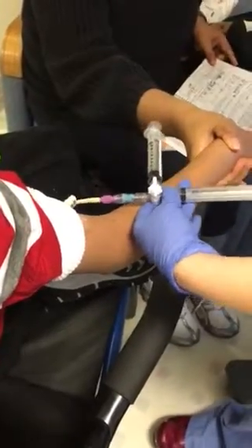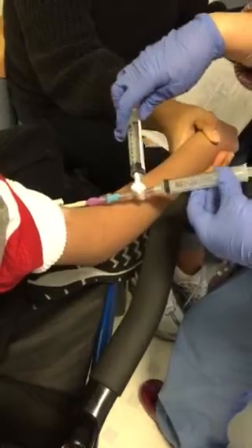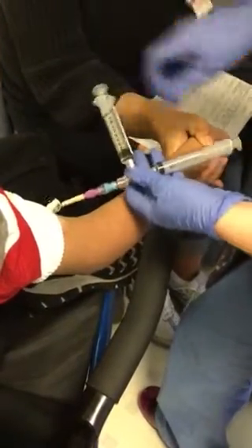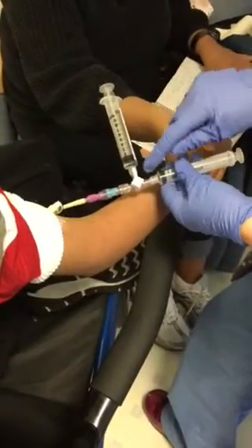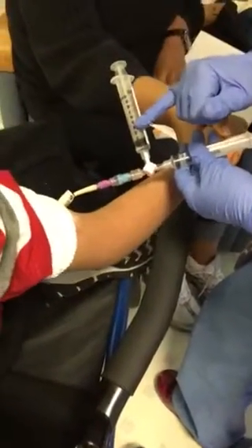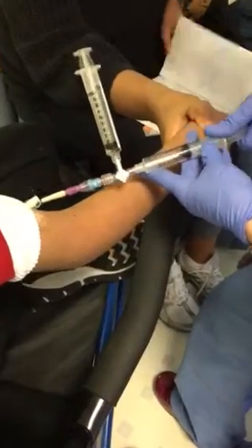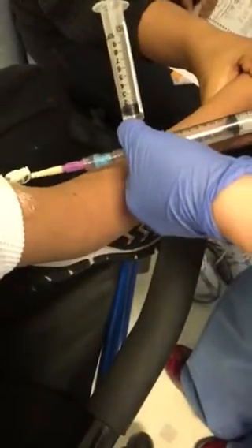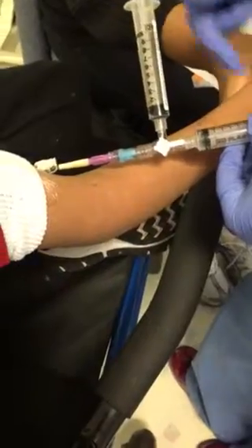Okay, so this patient's line is totally occluded, so we are going to give tPA with a stopcock via negative pressure. So I'm going to try to aspirate. Nothing comes. So currently I have my off lever to the tPA, and I'm going to pull back to the 7 to 9 cc mark on my empty 10 cc syringe, and then I'm going to turn the lever off to that. And the pressure will pull back the plunger.